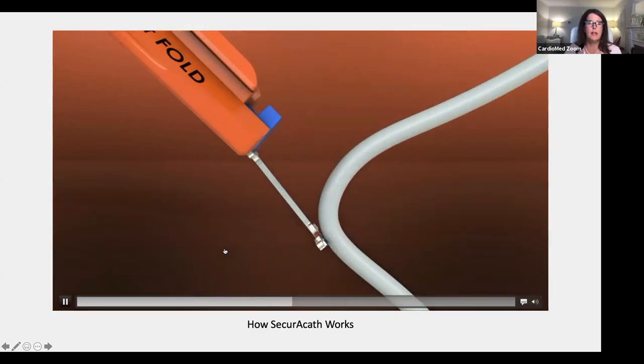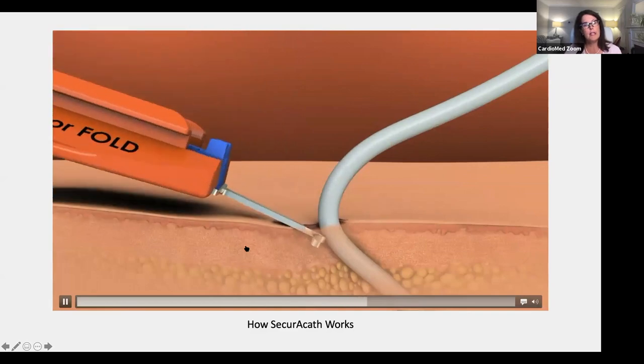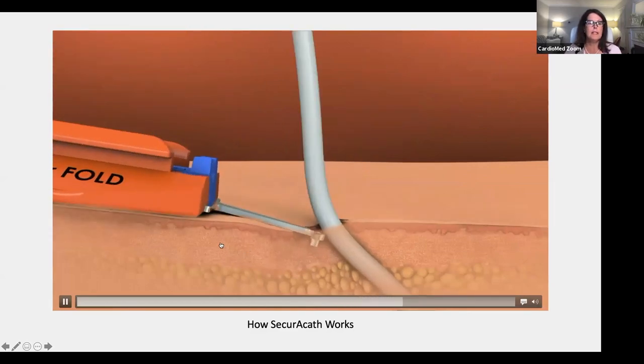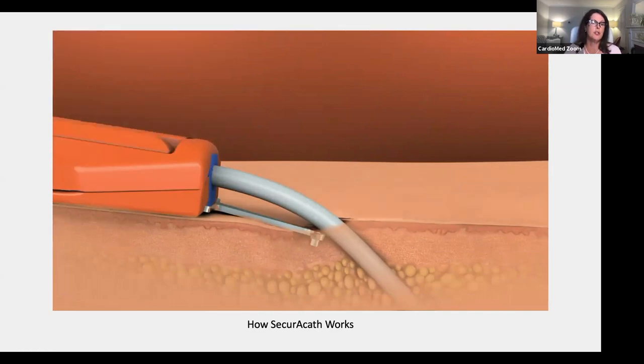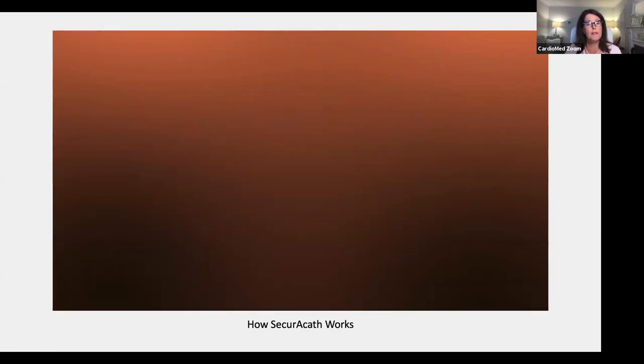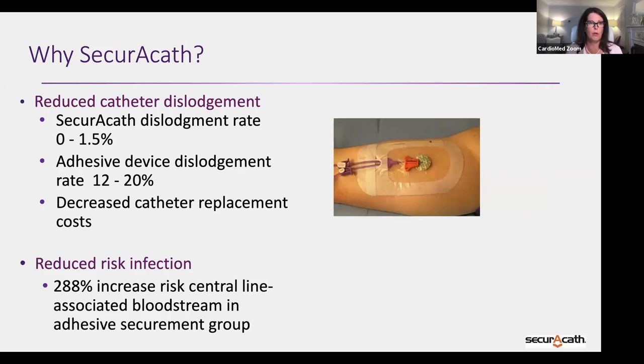The clinician then lays the SecurAcath down on the skin, and the PICC is placed in that groove in the base of the SecurAcath. The clinician will then put the lid on top of the SecurAcath to hold it in place. So that's essentially how the clinician will insert it and how it works.